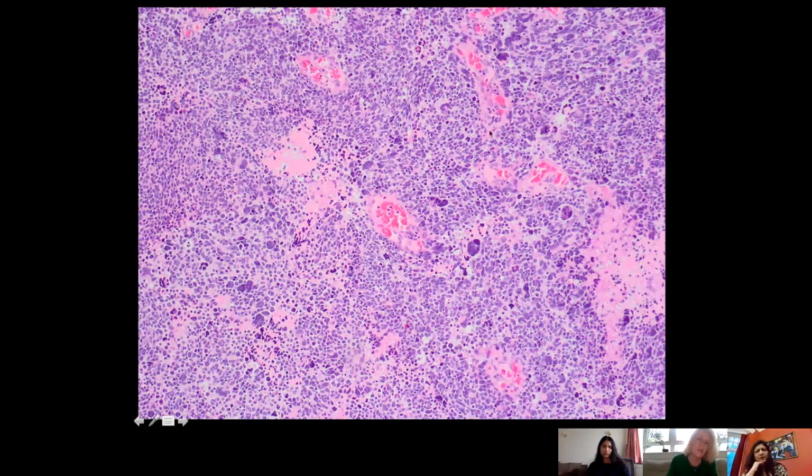Microvascular proliferation here is quite important because it is an almost unique, I would say, feature of high-grade gliomas we rarely see in other tumors. So if we see a tumor with this morphology, which could be more or less anything, it's really poorly differentiated, finding microvascular proliferations points strongly towards a high-grade glioma.